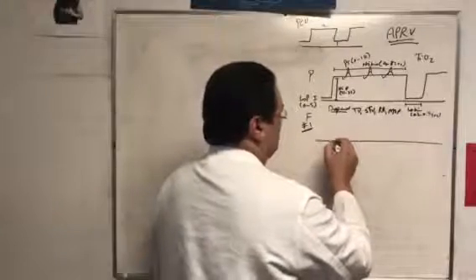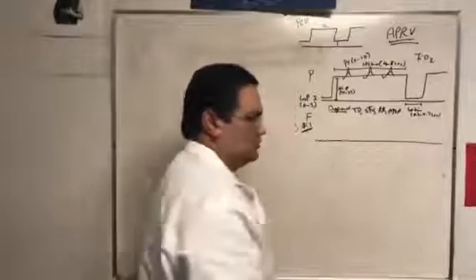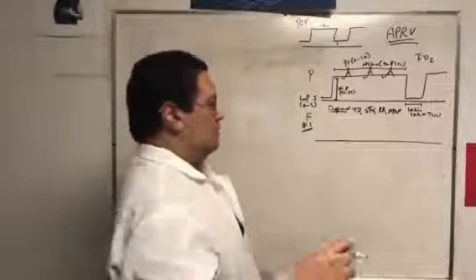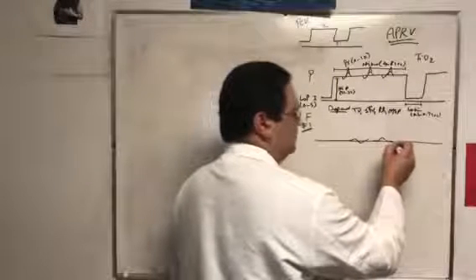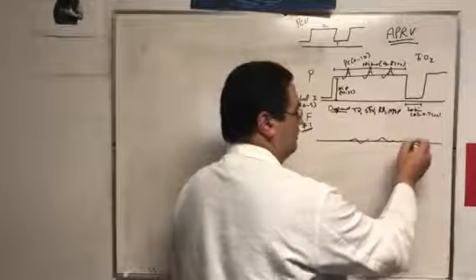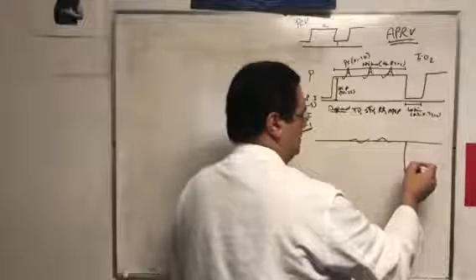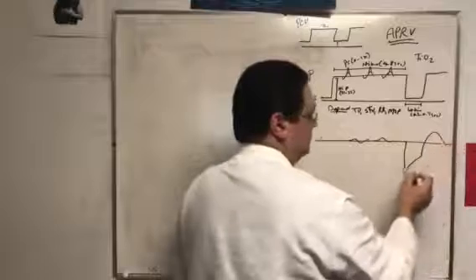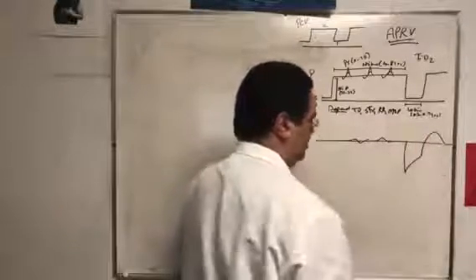So the flow is basically no flow. No flow, nothing. You saw my chest, like nothing is going, except maybe the little breathing on your own here. But the major flow happens when the release breath happens. We call that the release breath. It goes like this. That's the major flow. It's all in the negative, mostly in the negative, right?